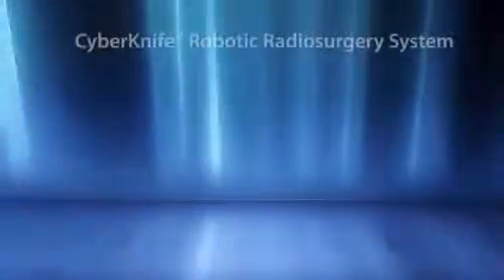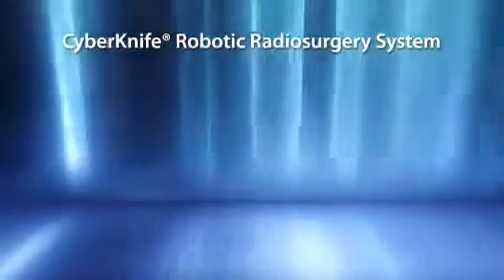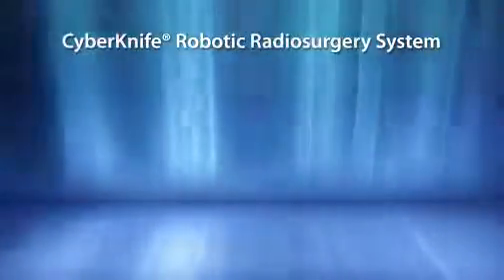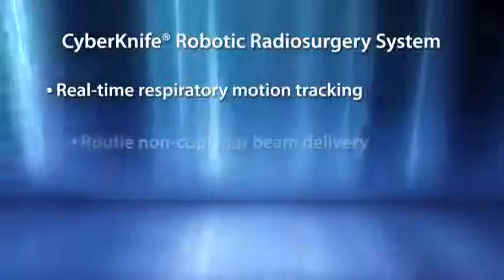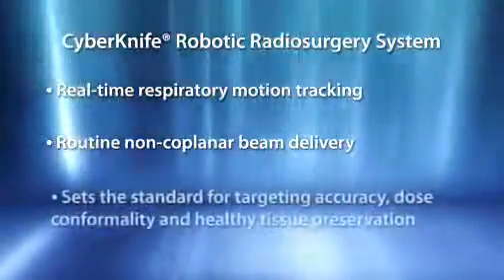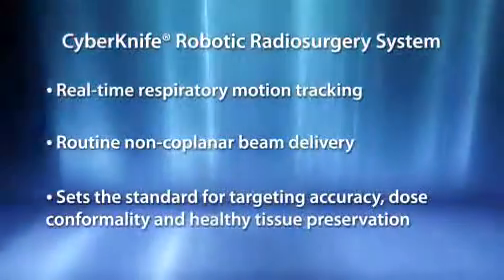In conclusion, safely delivering lung radiosurgery presents considerable challenges given continuous respiratory-induced motion and significant surrounding healthy tissue. With real-time respiratory motion tracking combined with routine non-coplanar beam delivery, the CyberKnife has set new standards for targeting accuracy, dose conformality, and healthy tissue preservation.